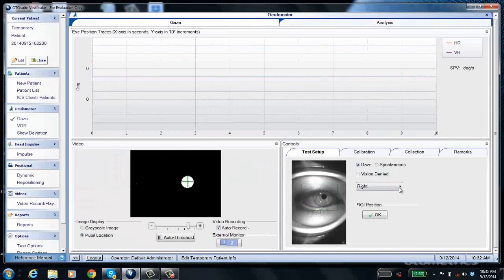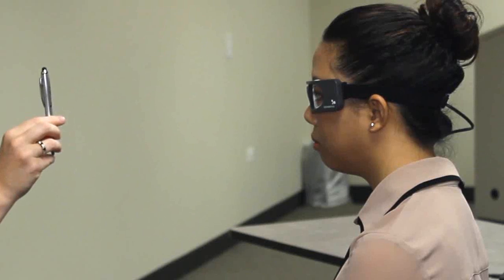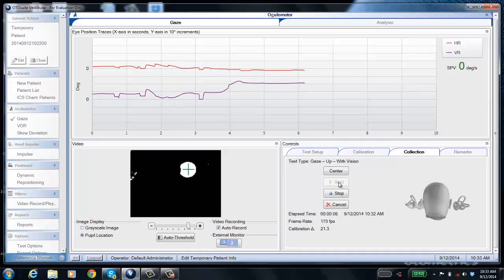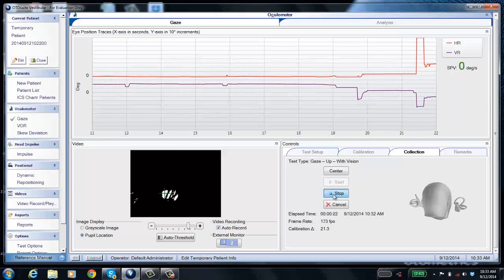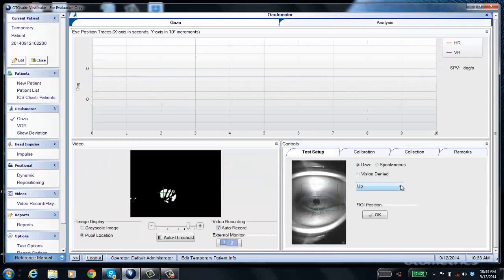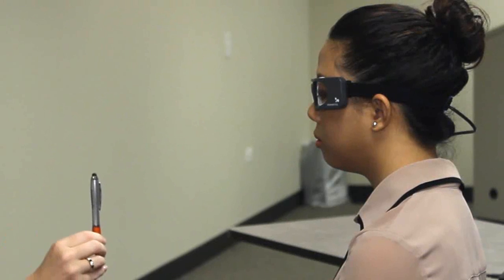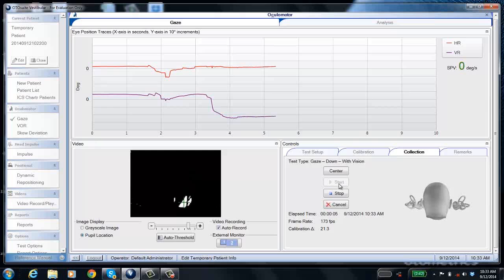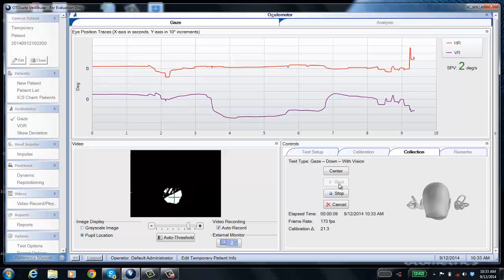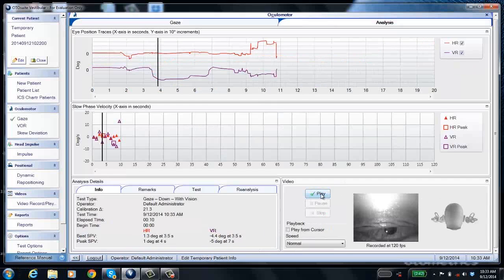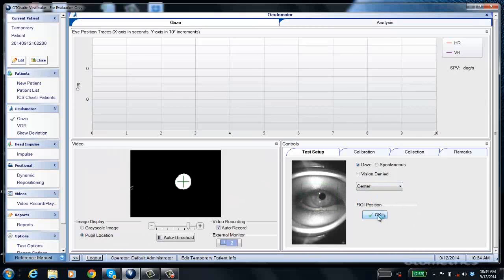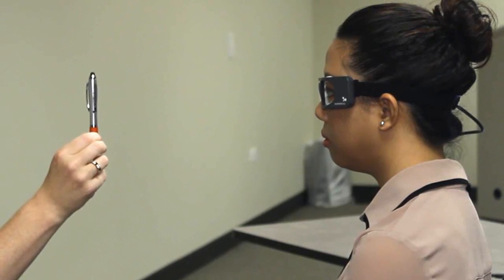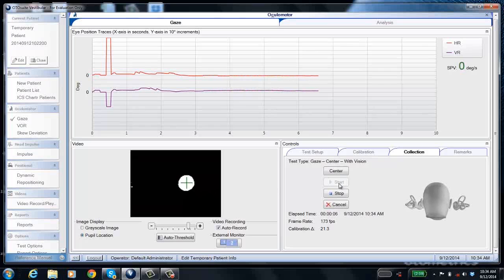Next, ask the patient to look up — again, no nystagmus. Stop the test, set it to down, and ask the patient to look down. Again, no nystagmus, so stop the test. Note that clicking the center button is only necessary if head position feedback is on; if it's not on, you don't need to center the head every time, and you can do that from your presentation remote. Finally, ask the patient to look straight ahead for the center position — again, no nystagmus — then click stop.